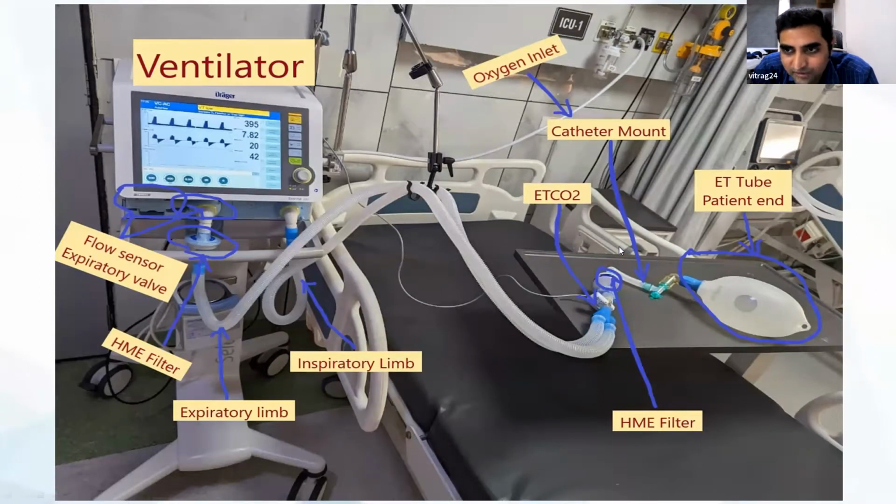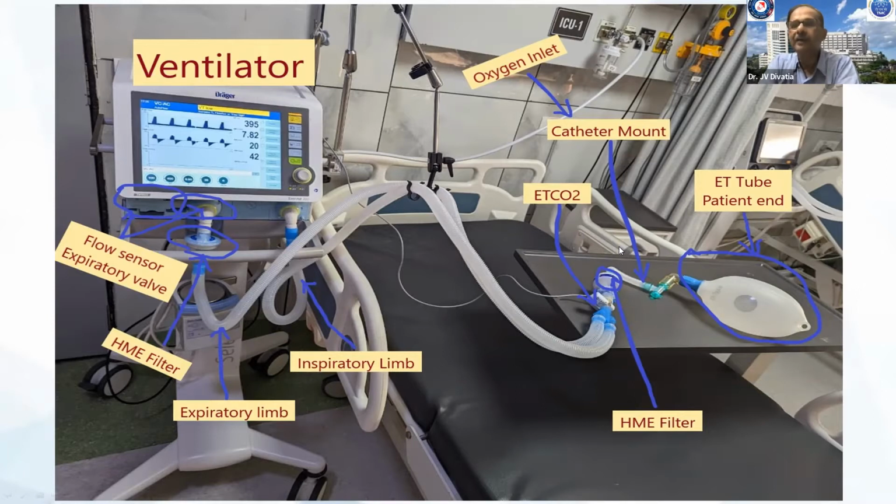Role of humidifiers. So the standard humidification that we use is the HME filter, which is a sort of passive humidifier. The heat and moisture from the expired breath of the patient is trapped in the membrane of the filter, and that is added to the next breath, which is good enough for most situations, and it sort of covers the humidification for most situations.